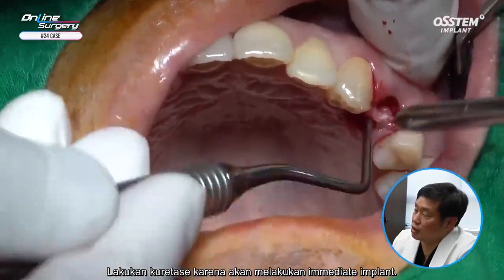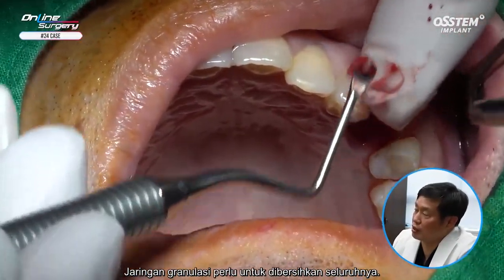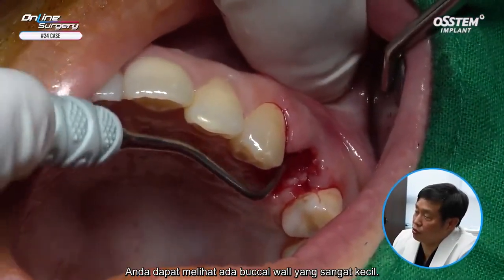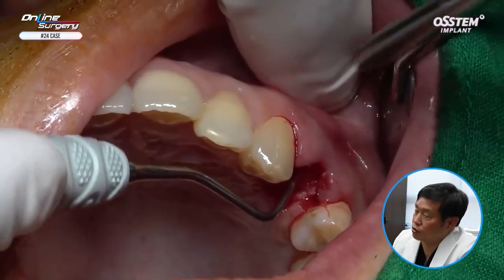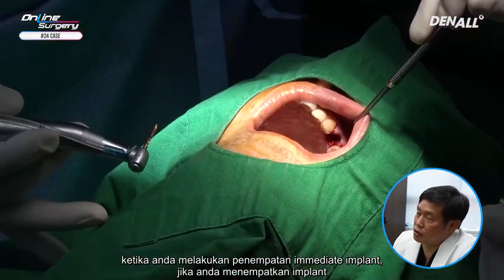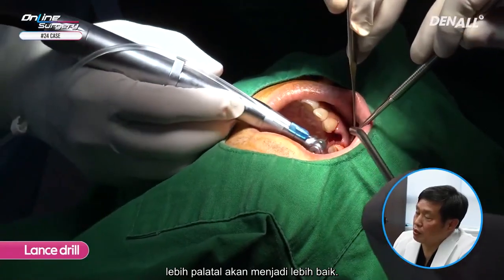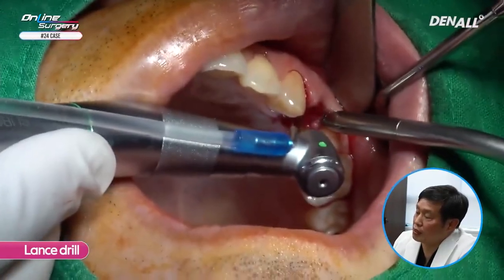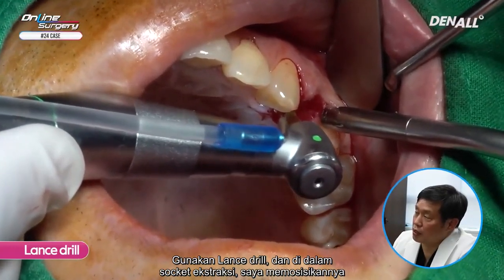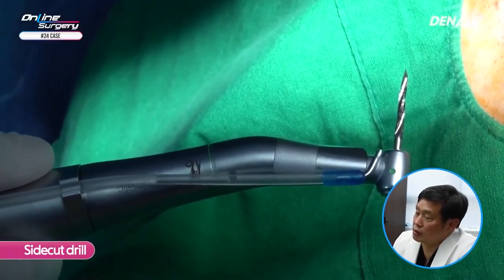Curettage has been done because immediate implant placement will be done. Granulation tissue needs to be fully removed. You can see that there's very little buccal wall and exposure can be observed. When you do immediate implant placement, if you place the implant more palatally, it'll be better. Lance drill is used. And within the extraction socket, I'm positioning it towards the palatal side.